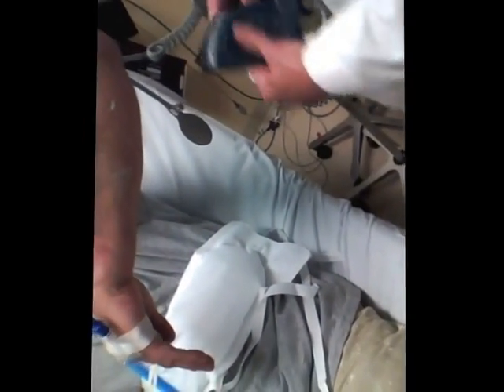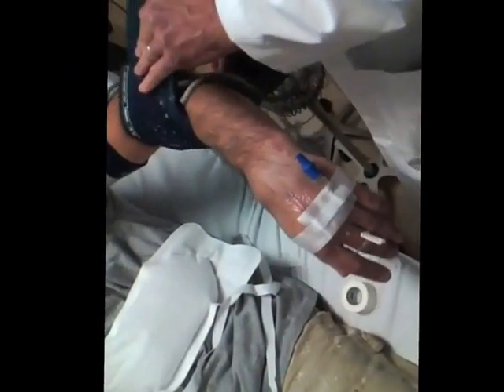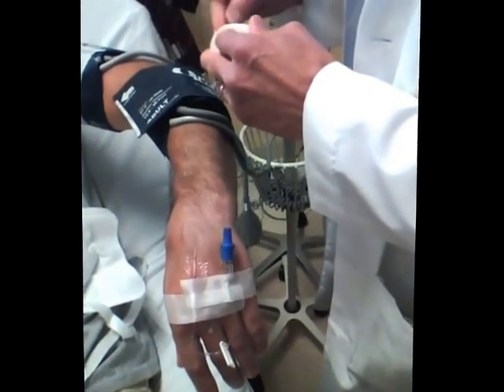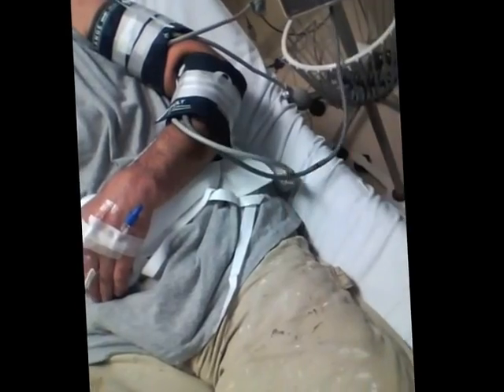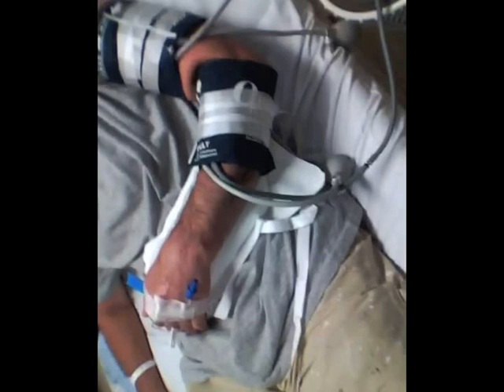The pressure in the cuff is inflated until it is at least 50 millimeters above the patient's systolic blood pressure — most people will take it up to almost 300 to be sure. Once the cuff is inflated, the tubing itself is clamped, because most blood pressure cuffs will leak unless firmly clamped. Neither the bulb valve nor the manometer can be relied on to hold pressure. Some people will wrap the arm with web roll and put the blood pressure cuff on top for added patient comfort.